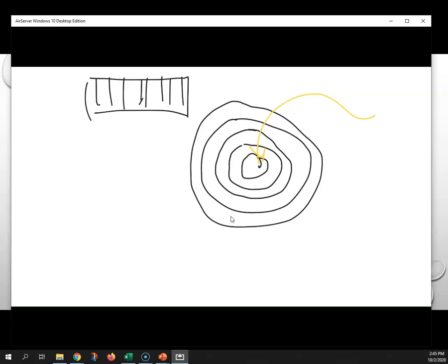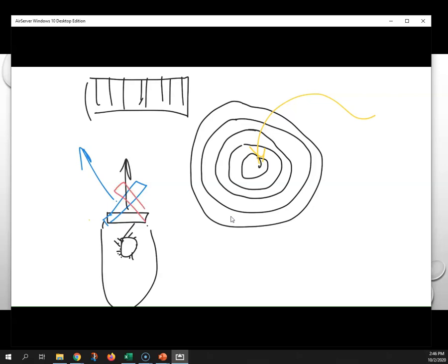And it worked just like a mechanical array. From the side, you would have the casing that holds it, and then you'd have this flat crystal in here that was made up of many circles, and then it had to be directed somehow through a mechanical means. That's supposed to be a gear that would wobble this thing back and forth, so that if it was pointed towards the left, then it would send out a beam to the left. If it was pointed straight down, it would send it forward. And if you pointed it over to the right, then you could get a beam to go off to the right. So this whole thing had to be rotated back and forth in order to make it work.